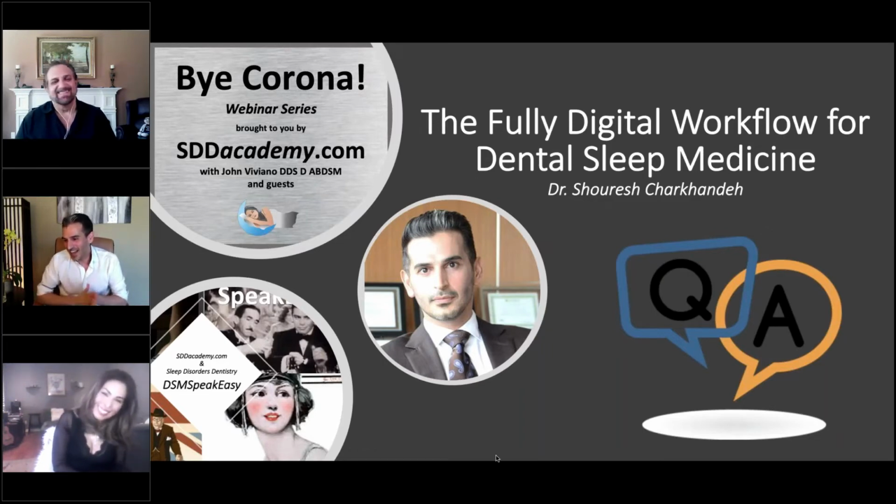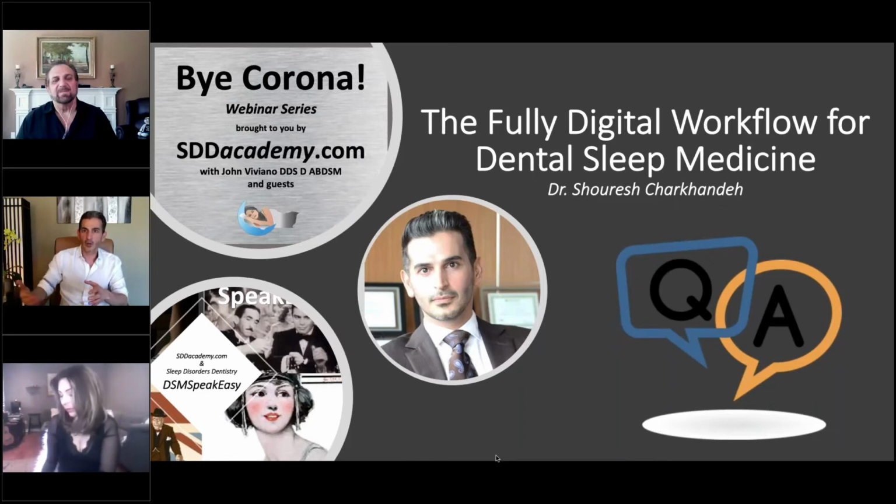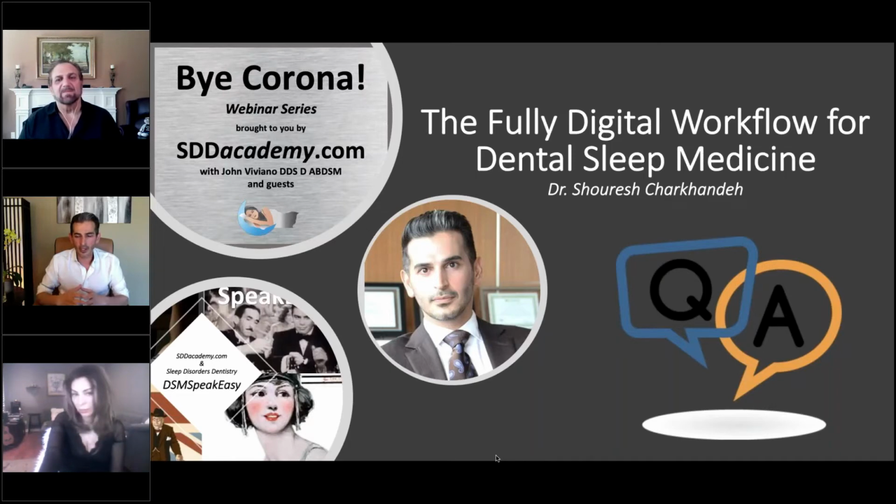In the same way that there is no best appliance for patients, there is no best scanner. It really depends on your clinic, your practice. Are you limited to sleep? Are you not? Are you doing ortho? Are you not? Are you doing restorative? Are you not? What other digital technologies do you have in your office, right? And how is your scanner going to talk to those? Is it open platform or not? If you have a 3D, is it something that communicates seamlessly or not? So those are the variables that you want to think about, what's available in your area and what kind of support.